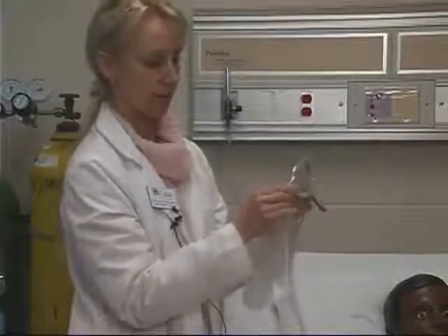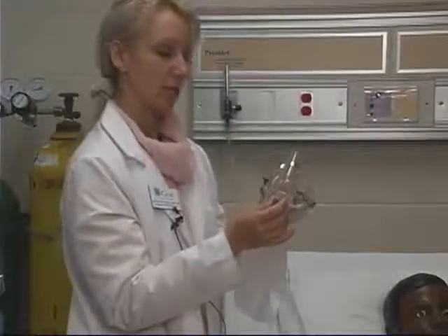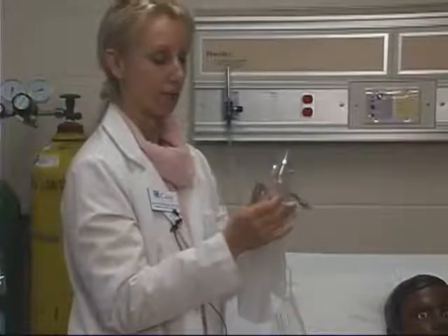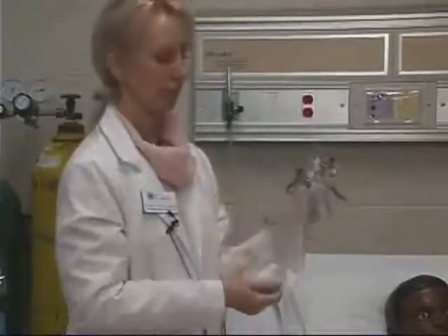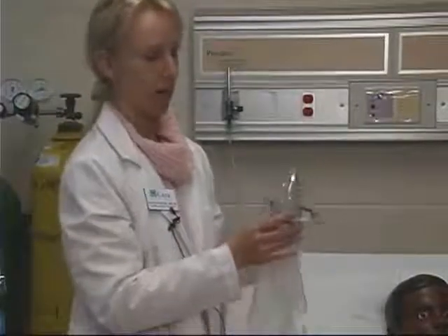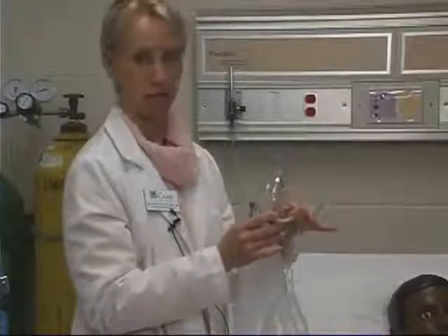So in summary, this device, for example, set at between 6 liters on the flow meter per minute up to the highest that the flow meter can go, which is 15, from 6 to 15. This can deliver anywhere from 60% up to possibly 100% oxygen to the patient. And again, it's measured by how much oxygen is actually being delivered by a respiratory therapist, and then the respiratory therapist will adjust the flow meter accordingly to make sure that the proper amount of oxygen is being delivered. And that ends the demonstration of a non-rebreathing mask.